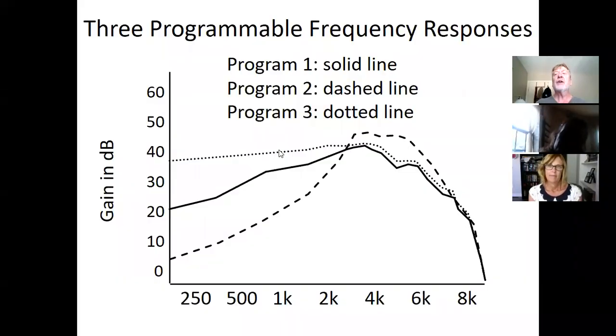So that's programmability. One of the salient features of programmability is the client can change stored frequency responses. You're the clinician, you've programmed the hearing aid, and now the client can toggle among the programs. Usually people might have about 3 programs max. Nerds will want more, but usually people can't deal with that. Most people get mixed up about how to put the battery in the hearing aid, so giving them too many options gets too complicated, if you know what I mean.